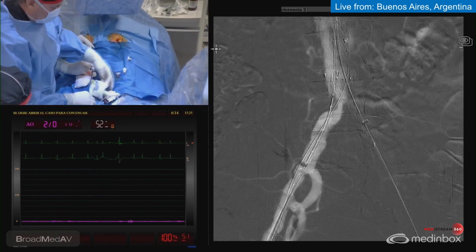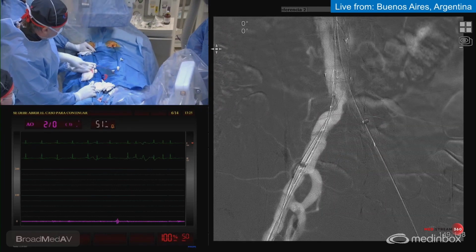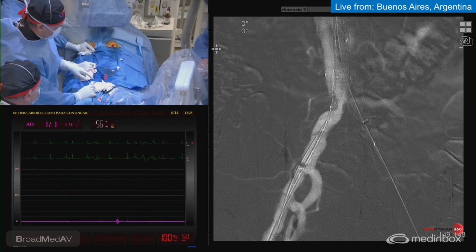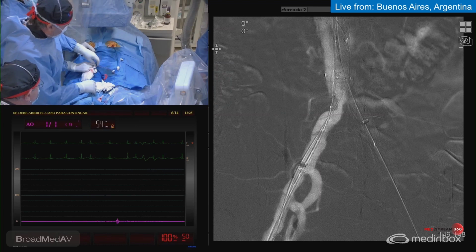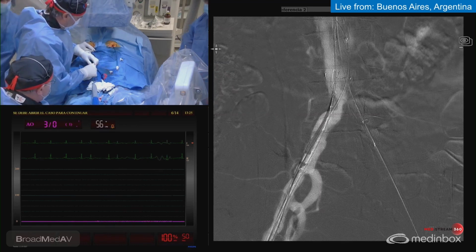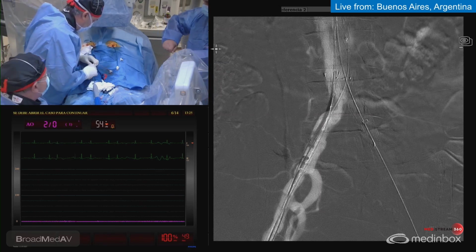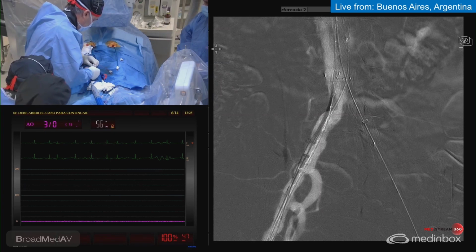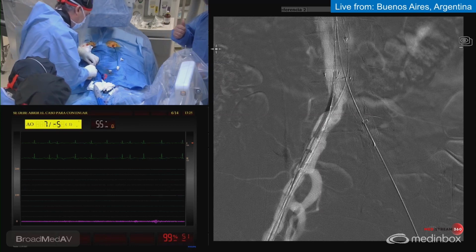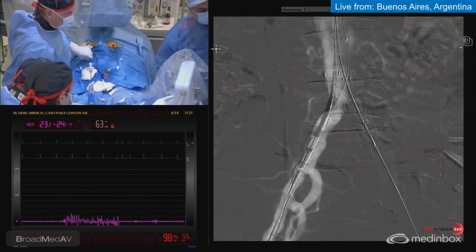So what I have to show you here, that here we have some connector that should be exactly in the outer sheath to be plugged, to be sure that we are working perfectly. Let me show you. So I'm pushing here. It is supposed to enter. It is supposed. Like now, I felt the click. It's okay. And now I have to advance everything together.